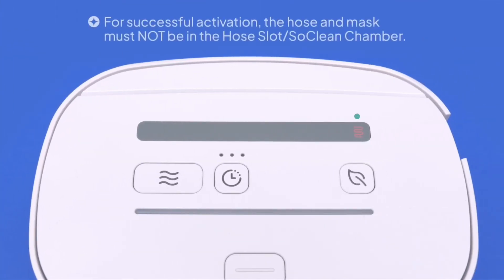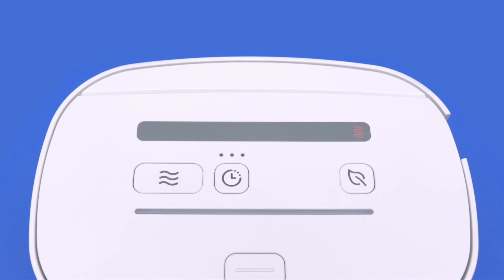If this is your first time using your SoClean 3, the final step is to activate it. Press the control panel buttons in the following order.